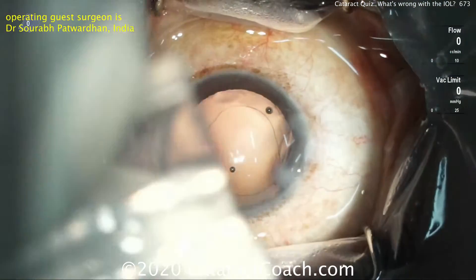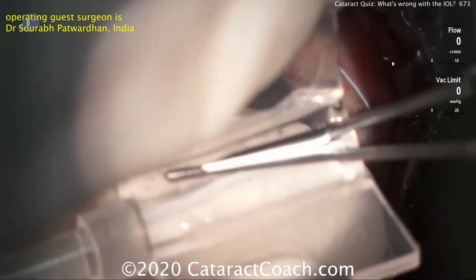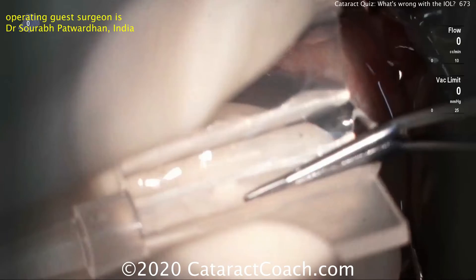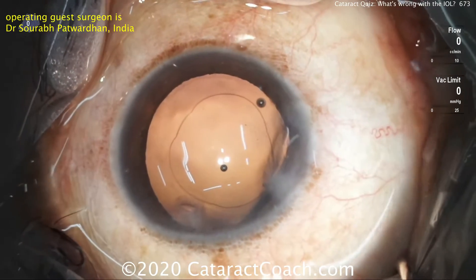Now this patient is getting an IOL that we don't have available in the U.S. This is a single-piece lens with four haptics and a multifocal optic being placed in the injector here. And this will be placed into the capsular bag.